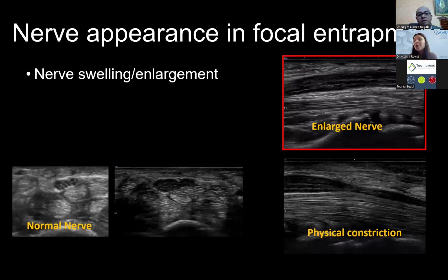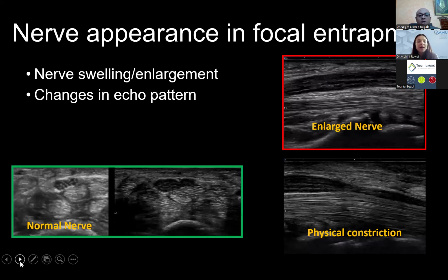Elastography, yes. Elastography is an assessment of the stiffness of the nerve. What about your idea about this technique? Yeah, so that speaks to, again, I did not include the elastography portion in this talk, but that speaks to this stiffness part.